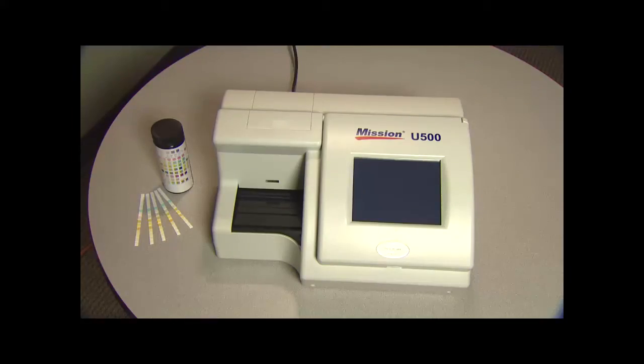It stores up to 2,000 patient records. Other features include automatic calibration, self-test capability, and a touch screen LCD for easy operation.